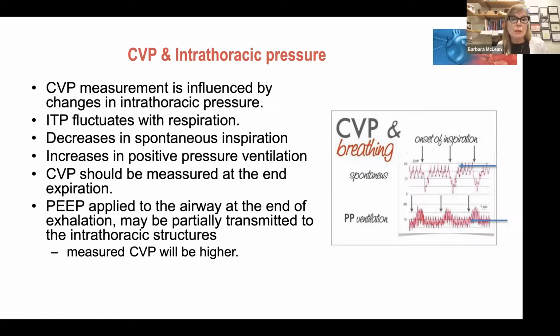Now, people talk about this as peaks and valleys. I don't really care if that's what helps you get through the night and monitor your patient, fantastic. I personally find that to be kind of dismissive of understanding the physiology. When I put positive pressure into the thoracic cage, that pressure is transmitted to the ventricle. That means the pressure goes up during inspiration and falls during exhalation. The opposite is true with spontaneous breathing. The only way I can get gas into the lung on spontaneous breathing is to generate negative inspiratory pressure with a diaphragmatic contraction, pulling the floor of the cage down. That makes the cage really big, and the pressure drops because now the cage is really compliant.